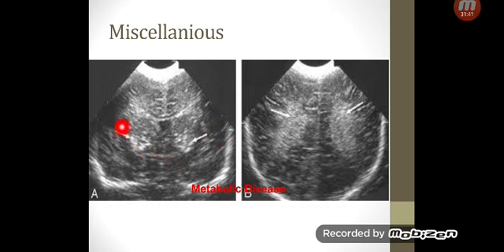So it's really interesting to know that you can also pick up something that might denote a metabolic disease. So if you happen to find something like that with a keen eye, you might need to think about metabolic disease, even if the child didn't start to present anything. Just at least something to discuss with your consultant, maybe.